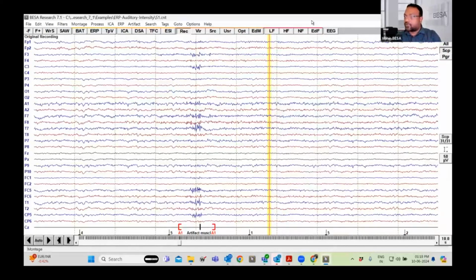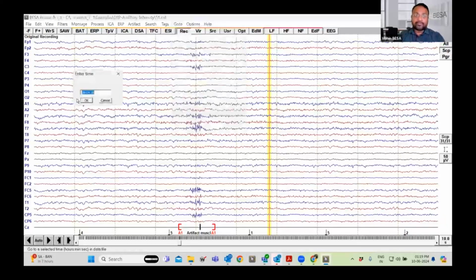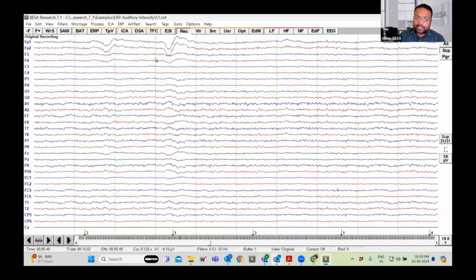Next, I want to take you to another point. Let us go to that point. Go to time. Let's go to 5 minutes and 14 seconds. We go there, and here we see eye blinks. Here, just double click on the peak.